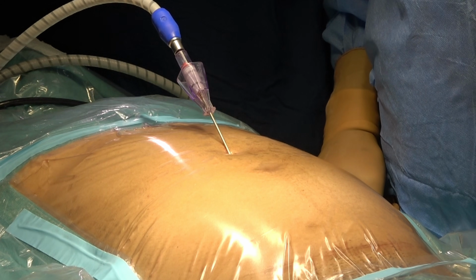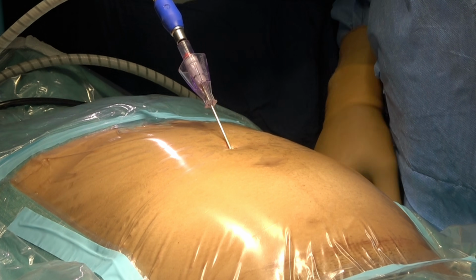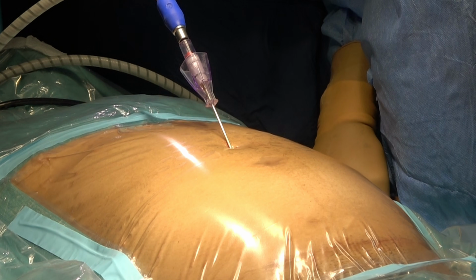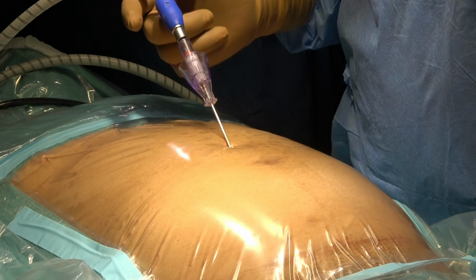First advantage is that you can rule out almost all the tubal causes of infertility, and in one session, in one anesthesia, you can complete all the fertility tests. So that's why it is important. And moreover, if you accidentally perforate in the submucous myomectomy, then also you will know what you did.